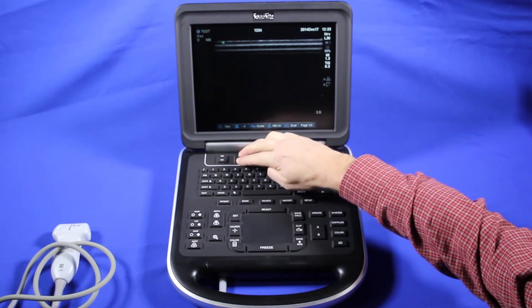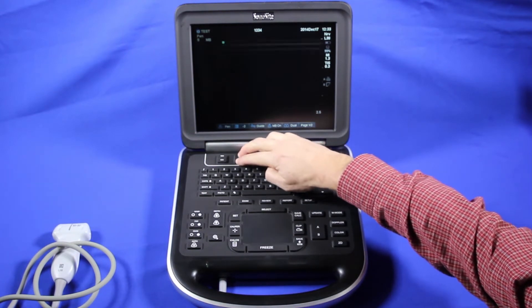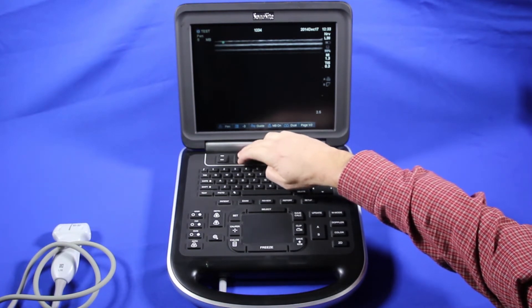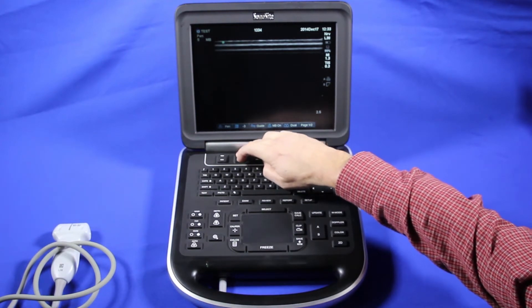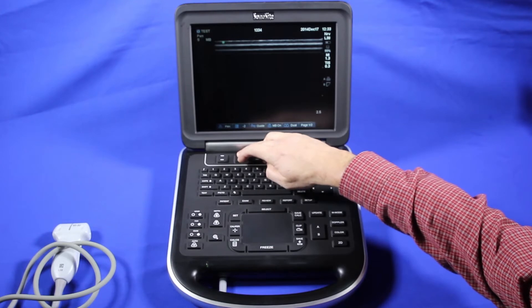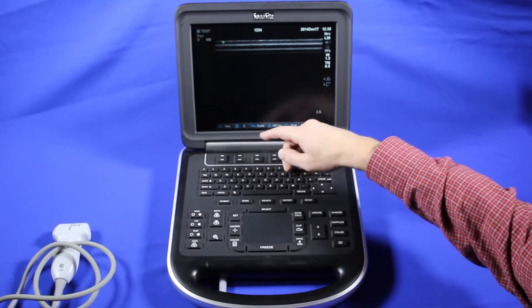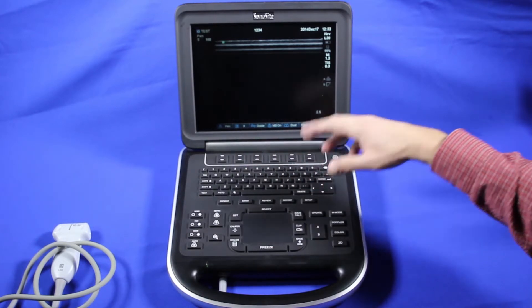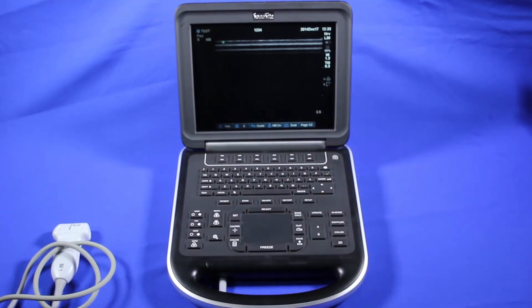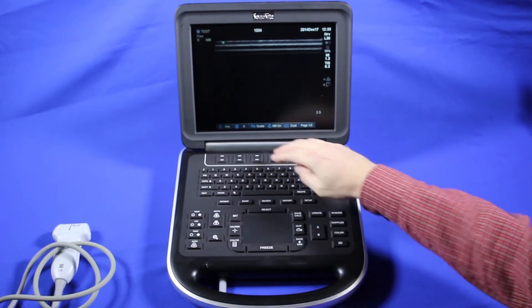Coming across, we have our dynamic range. You only have seven selections: negative 1, negative 2, negative 3, 0, and 1, 2, 3. You can use those to help optimize your images — to make it smoother or to have a higher contrast in your image.